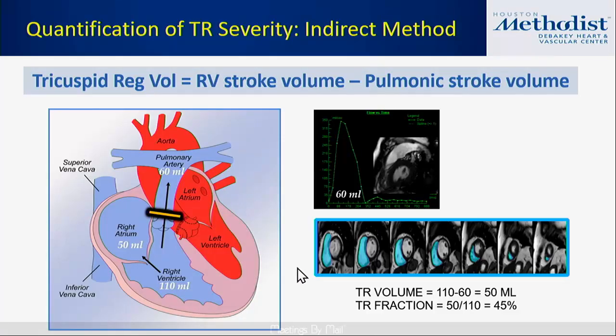So actually measuring the disc summation, knowing where to draw the barriers, knowing how to figure out the RVOT, how to get the volume below the tricuspid valve, these aren't trivial things. And when there is variation in the modality, that's generally where it is: the RV trace and the RV determination of size. Then you just simply subtract the pulmonic flow.